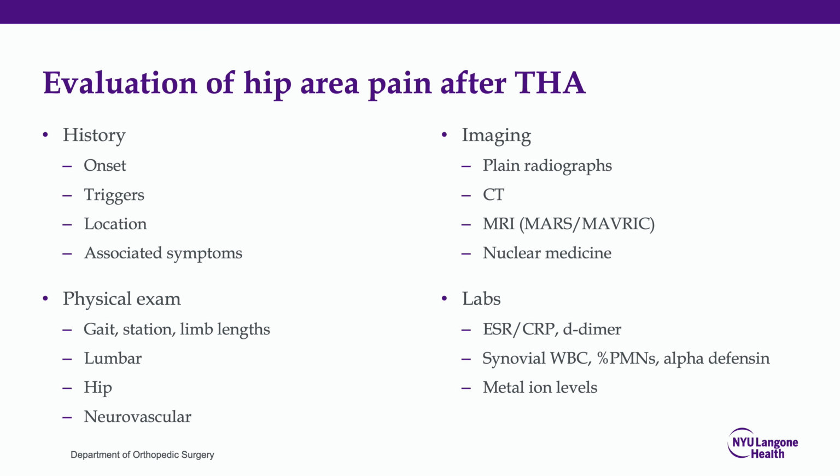CT scan can allow us to better quantify the volume of bone that's affected by osteolysis. It helps us understand the three-dimensional relationship between the implant and bone, and particularly recognize problems with femoral, but also acetabular anteversion. It can be used to better establish the size of bone defects and the integrity of the anterior and posterior columns, to rule out a pelvic discontinuity, although certainly various oblique pelvic views can help us with that assessment as well.